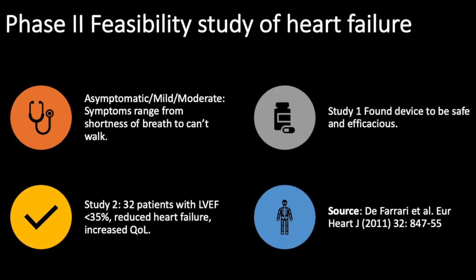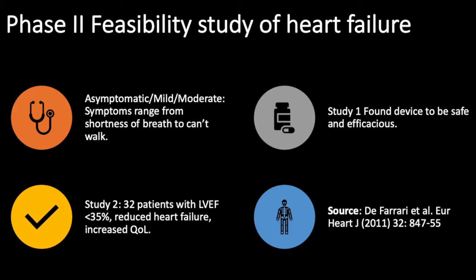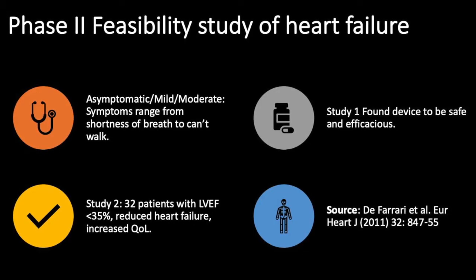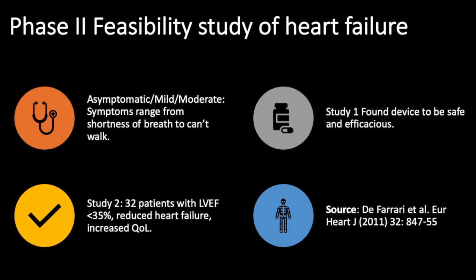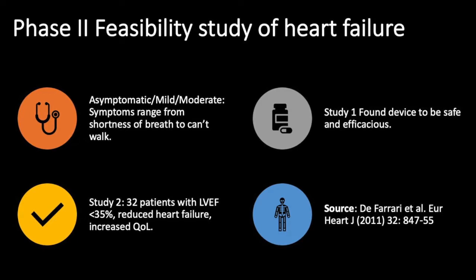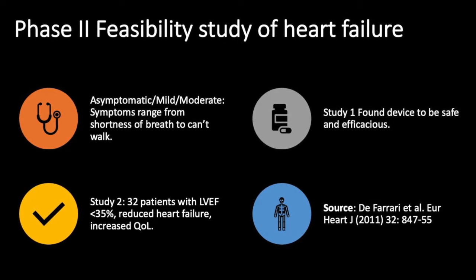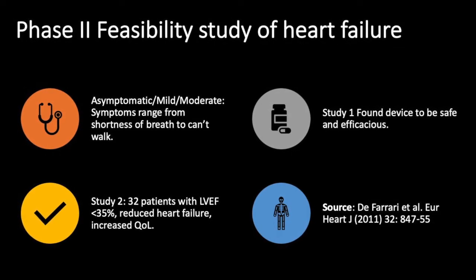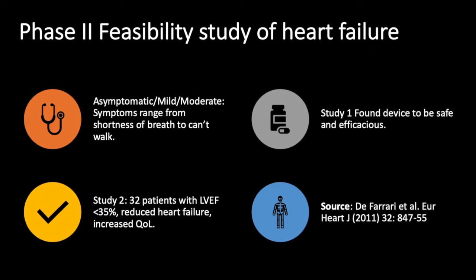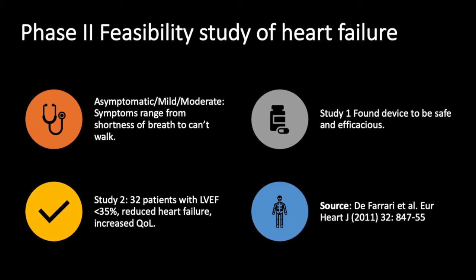Phase 2 feasibility study of heart failure. So there's been a study on individuals with asymptomatic, mild or moderate heart failure, and this can consist of symptoms like shortness of breath, or right up to where individuals can't walk without noticing irregularity of the heart rate. Study 1 of this particular study found that devices were deemed to be safe and efficacious.